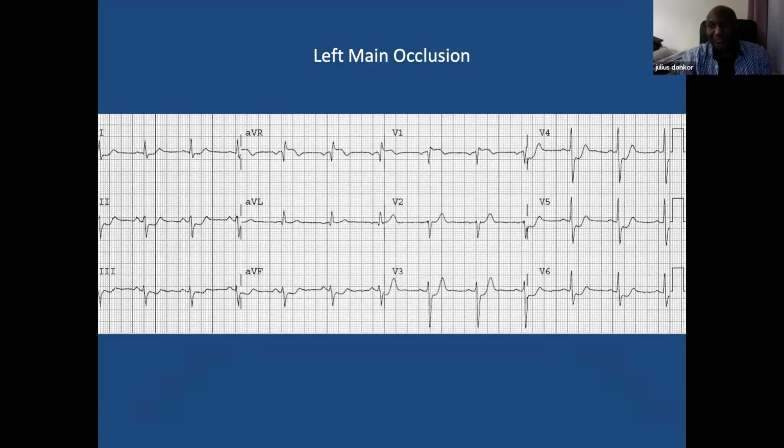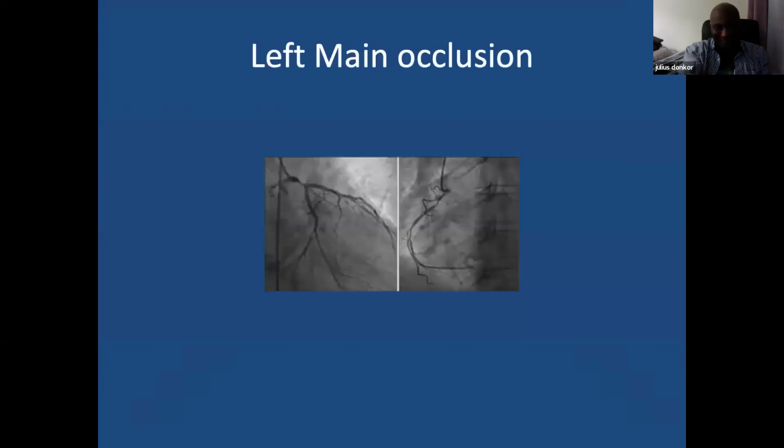Yeah, it's just remembering what it looks like. Those are patterns. So left main. On your angiogram here, we can see the left main occluded. Well, in fact, there's a reperfusion there, but you can see the distal portion of the left main is really significantly narrowed. So Dr. Daffy will be able to fix it and put a stent in.